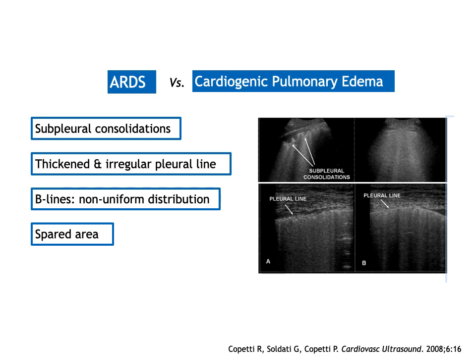And then we come to the important and million-pound question, as I call it, which is the difference between ARDS and cardiogenic pulmonary edema. Are we able to differentiate by lung ultrasound? I think we are, if we use lung ultrasound as part of an integrated approach with multiple imaging modalities, if we use it with echocardiography in the clinical context, with the other diagnostic laboratory modalities, we could get important information from lung ultrasound. And these are the different diagnostic criteria which differentiate ARDS and cardiogenic pulmonary edema.